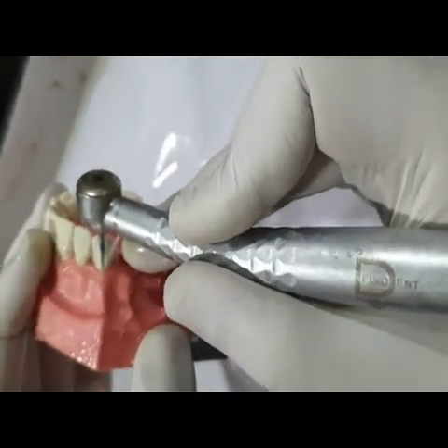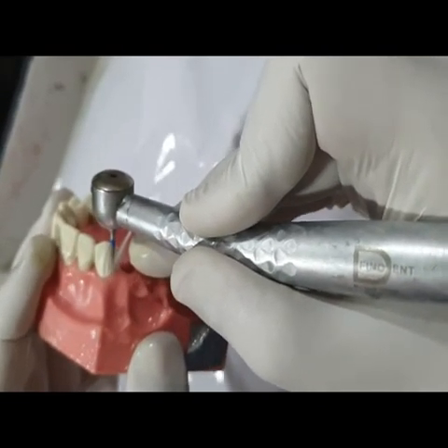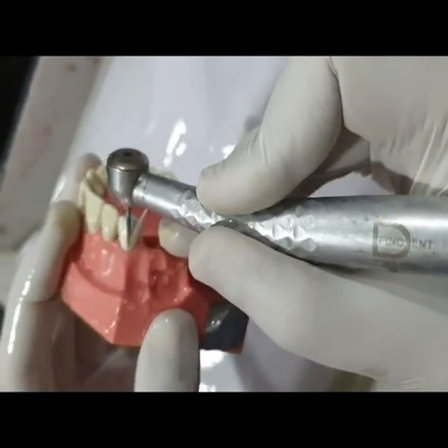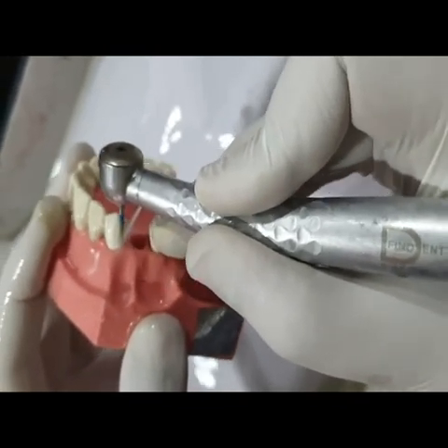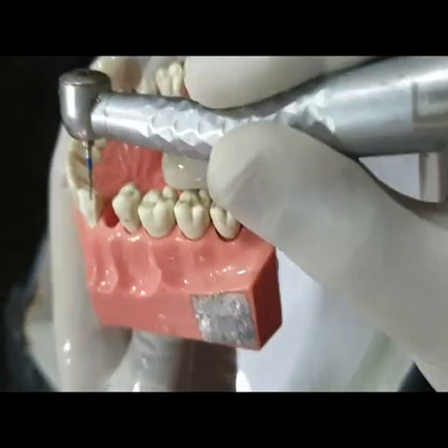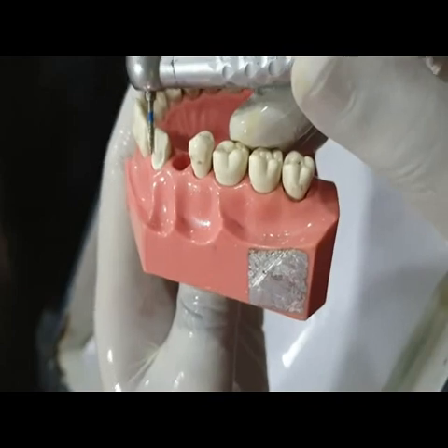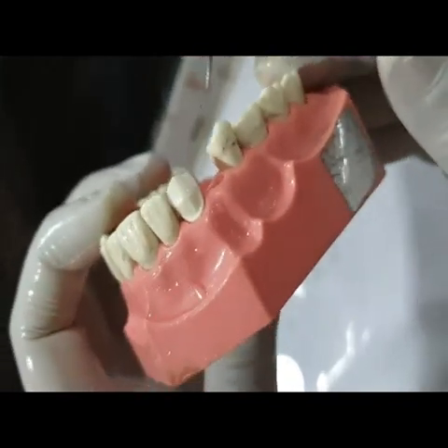Now coming to the cervical part. As I am doing the cervical reduction, my bur is not moving in a straight direction — it is following the CEJ and raising on both sides. This is very important to get a margin which is not going to harm the soft tissue. If you see this canine from the proximal side, the angle of the bur is slightly angled in the incisal two-third, and this is my cervical angulation. By doing reduction in both these planes, I have achieved a biplanar reduction.